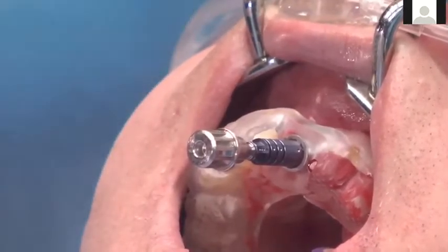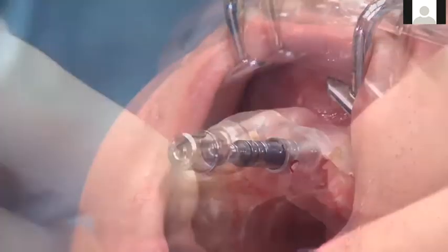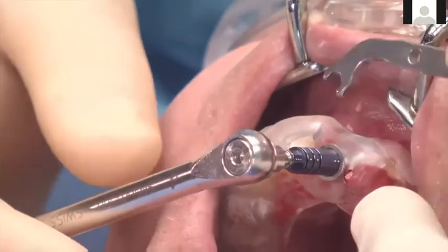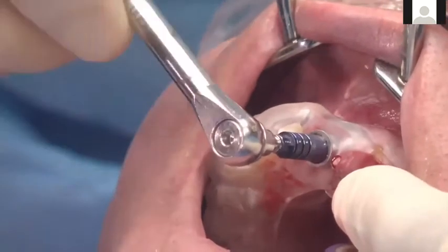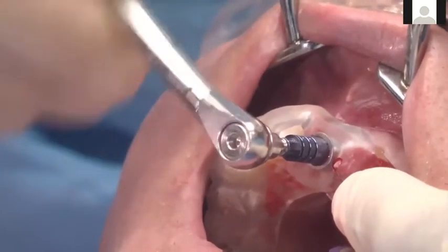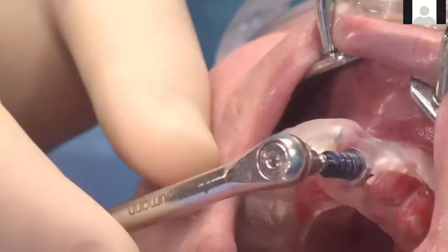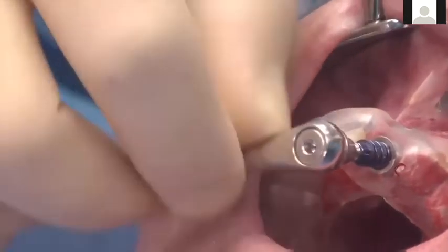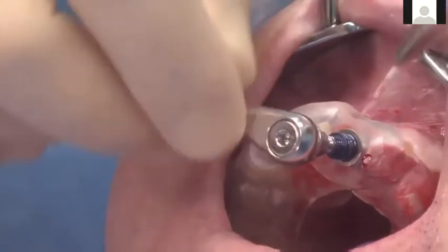So we go to that depth, but remember, we drill deeper. So then we have to either take the guide off and put the implant deeper, or use a different type of mount through the guide to place the implant deeper to depth. So here we are just ratcheting this in, obviously not this fast. This is just sped up for the video. But here you can see we go all the way with this guided mount all the way down to that H6 marking.